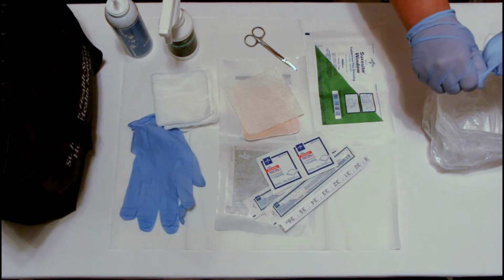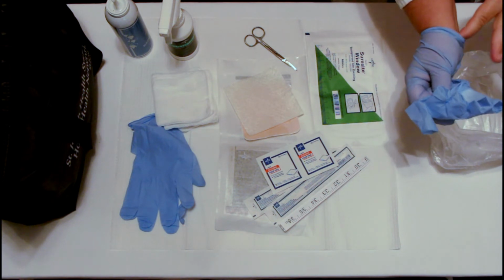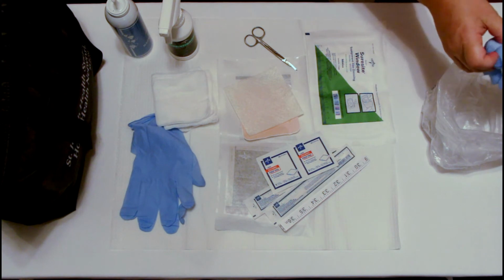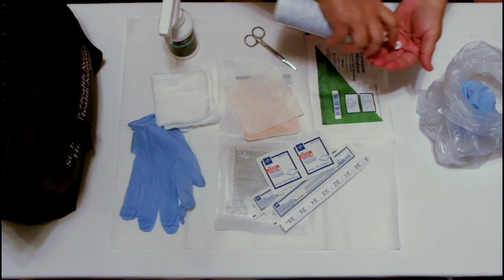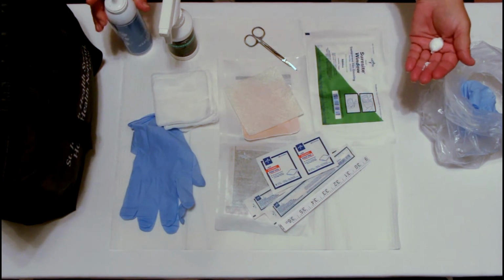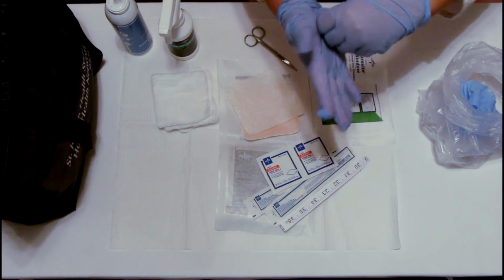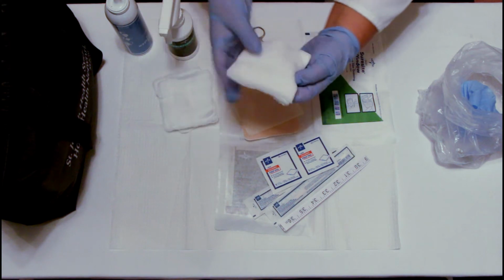The gloves are removed at this time, and hand hygiene is performed again before donning clean gloves. Now the clinician is prepared to clean the wound.